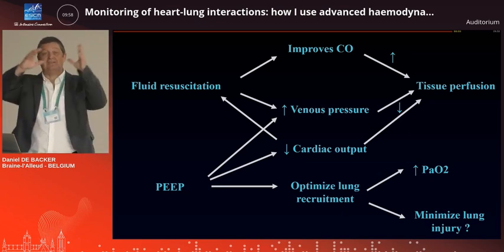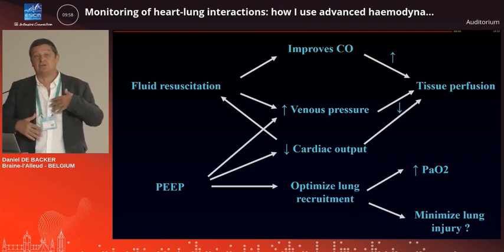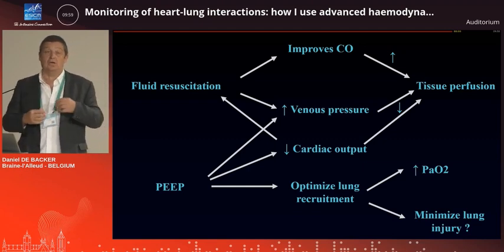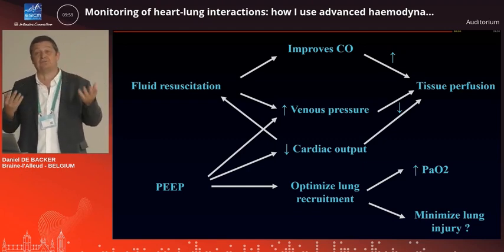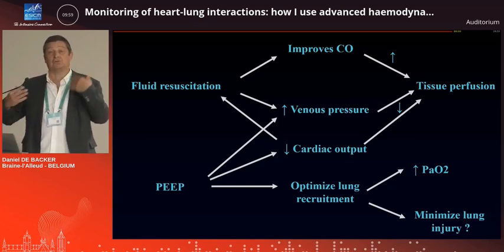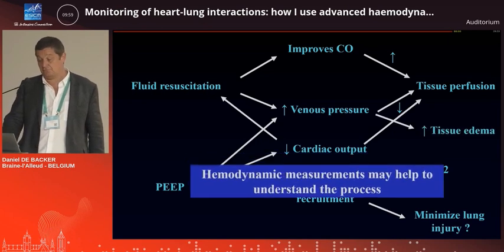So we need to integrate all these factors, and that's why I think that it's good to have not only these advanced hemodynamic devices, but also, again, to have the ultrasound at least from time to time to look at all the consequences, not only in the heart, but also in the peripheral veins in these patients. And with this, I thank you for your attention.